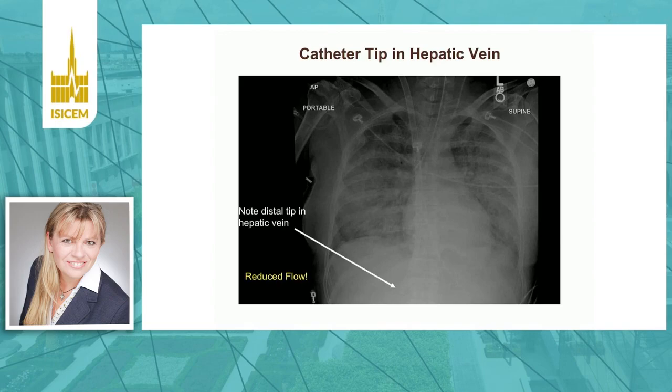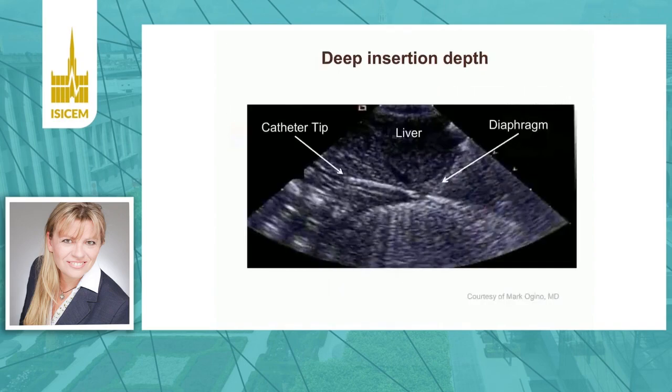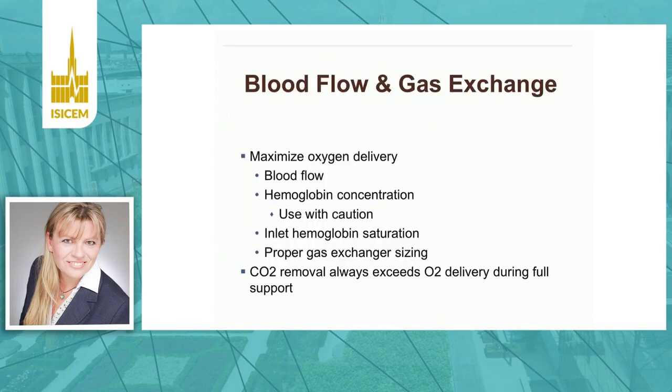This is the correct insertion depth of the cannula, with the infusion port outside, a bit of a long distance to the liver vein. And again, this is an example of too deep an insertion depth, and it should be corrected.